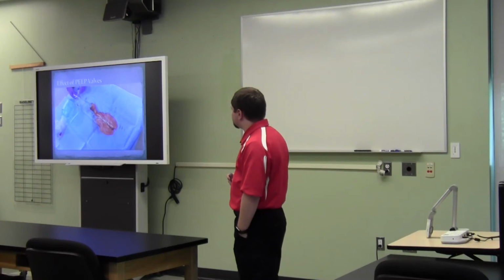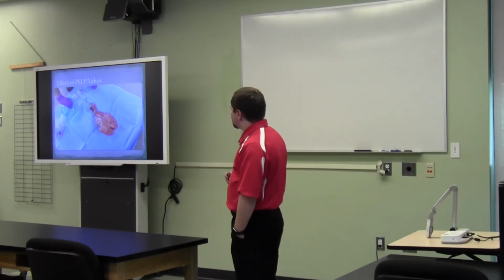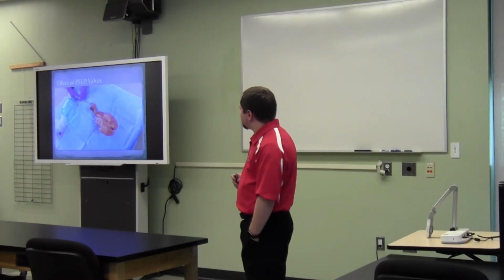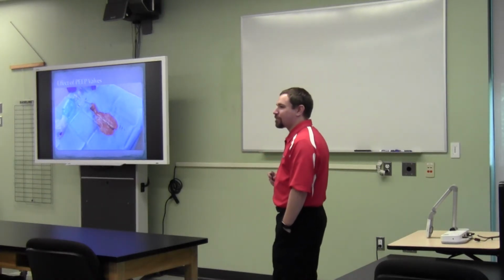Now we add a PEEP valve set to a PEEP of 10. We start ventilating. We notice we end up with much different deflation at the end of those. And just to really see what that PEEP is doing for us afterward, we remove it, say we're taking someone off the vent to suction them. Look what happens. We're going to have to recruit them all the way back up.